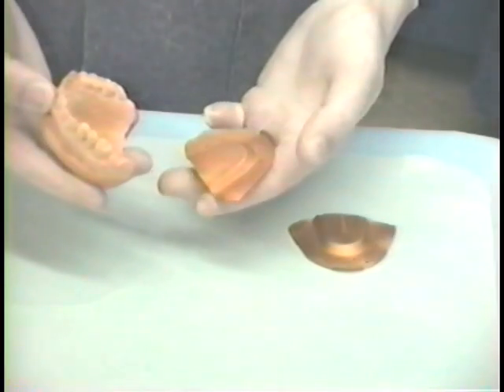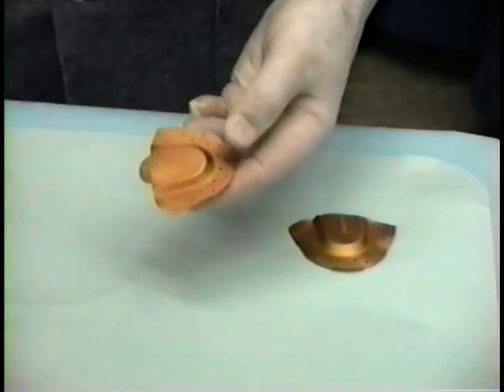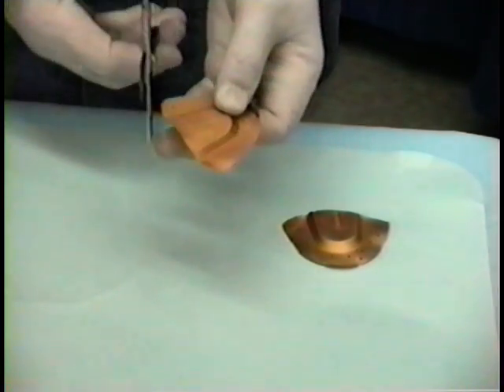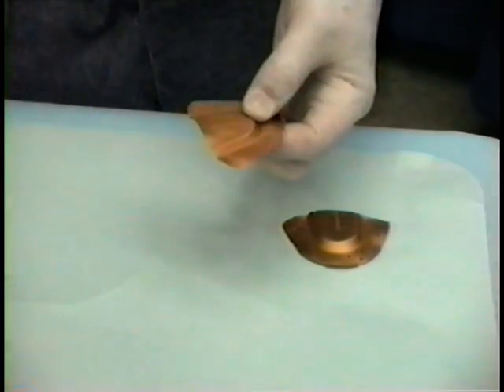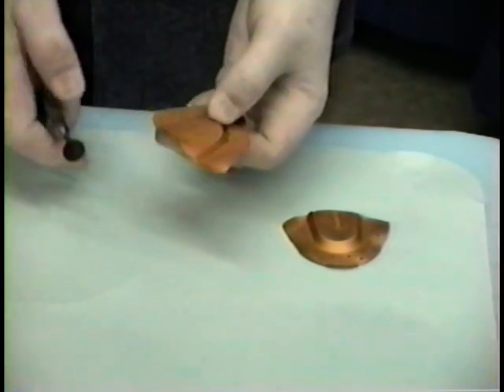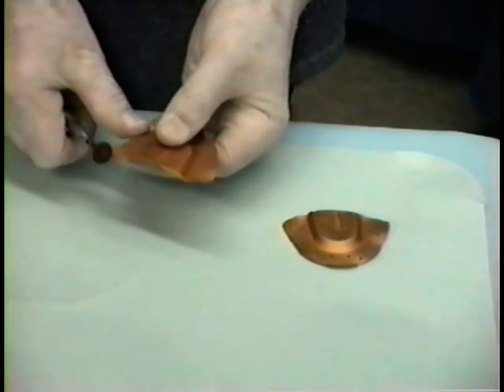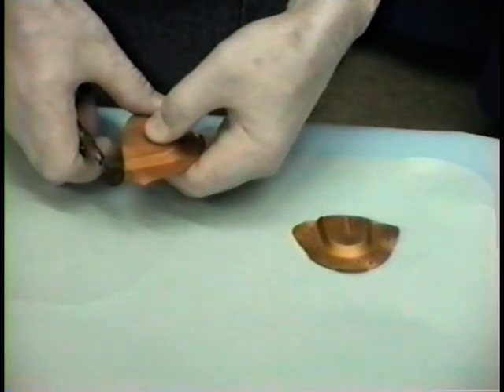If the casts of the patient are not available, we then have to try the tray in the patient's mouth to determine the length and cut it off in the same manner. After the tray has been cut off, we take our slow speed handpiece with a rubber abrasive wheel and polish the distal sharp edges if any exist.